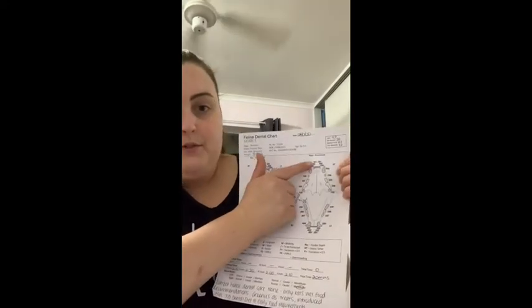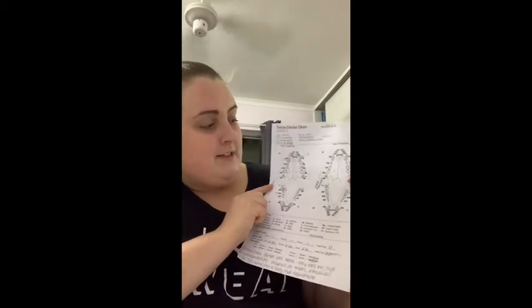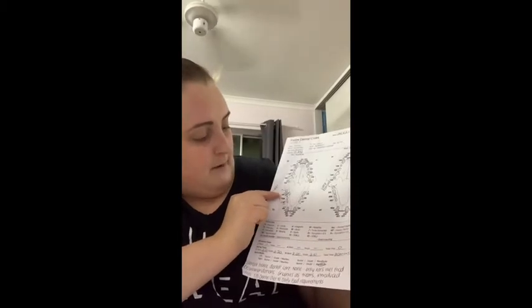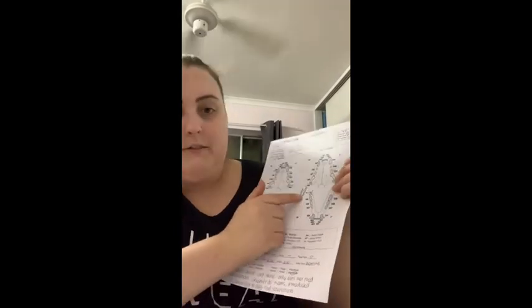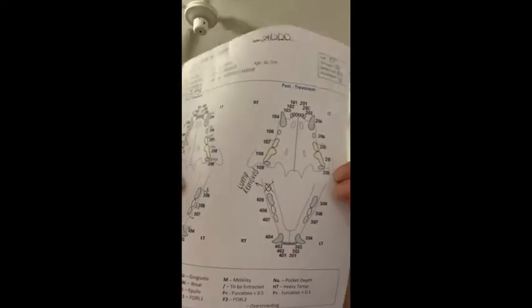You can see a pre-treatment up here and a post-treatment. Because it was only a grade 1 dental, there's not much that you can really write on the post-treatment. This particular animal did have a lump just above 409 here, and that was bleeding a little bit, so that was actually removed. So I have updated that here, so you can see it was removed.